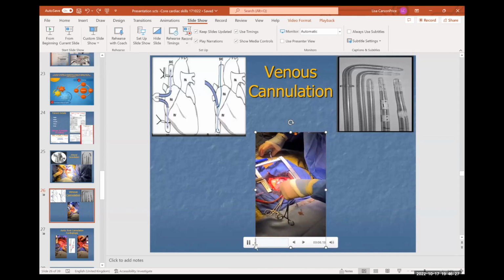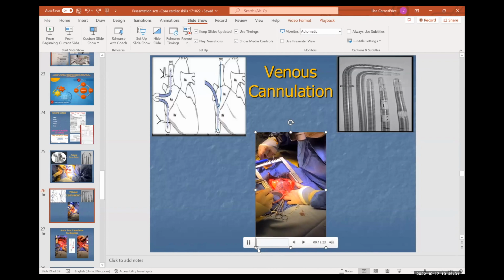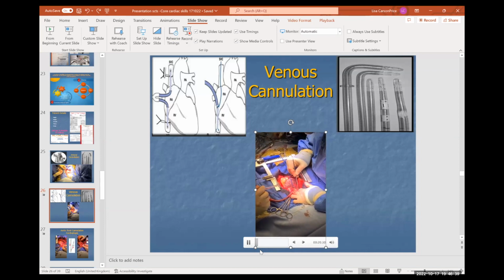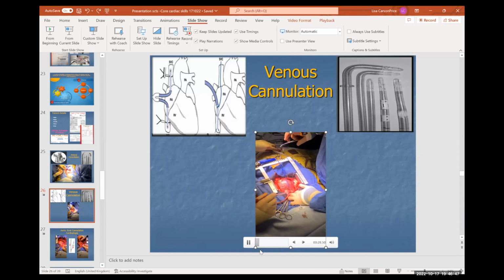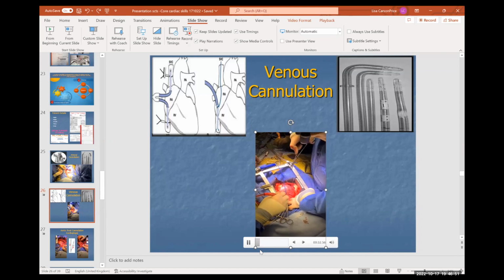Now I need the long knife, don't pull on that. I need the razor up to that and the curve. So it will do the same technique again. So that's the SVC. Small knife incision. He's put his finger in the hole. He's now going to push the cannula in. Now he's going to make that hole a little bit bigger with the scissors.